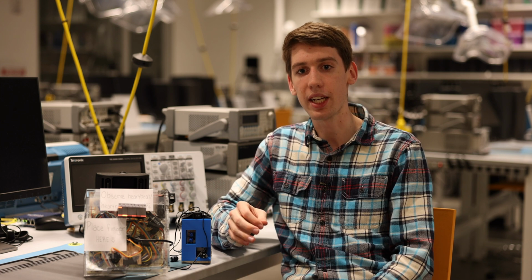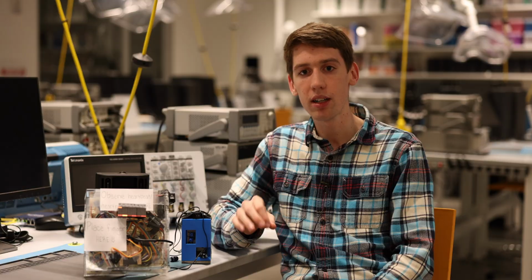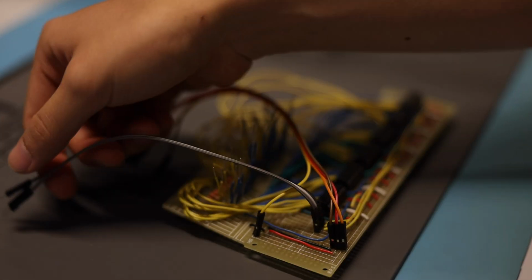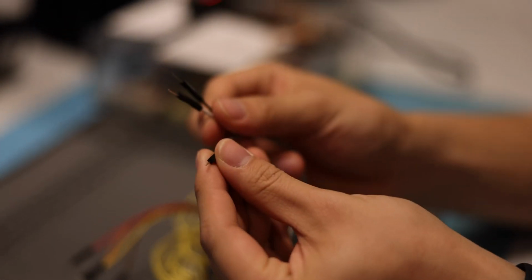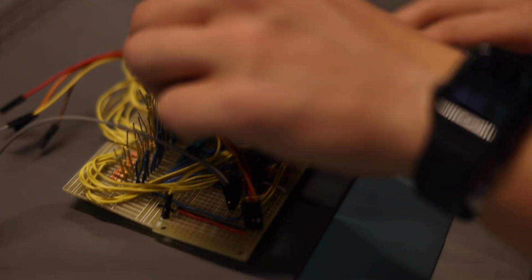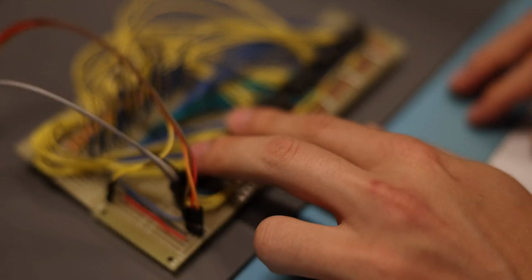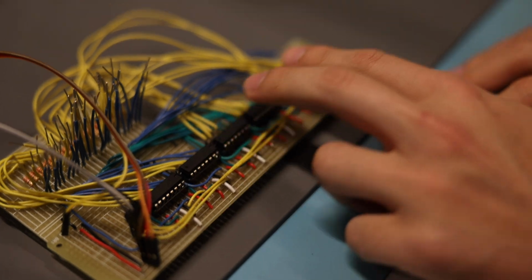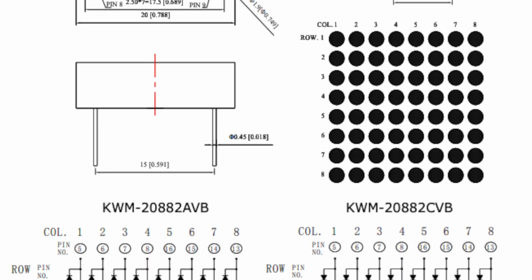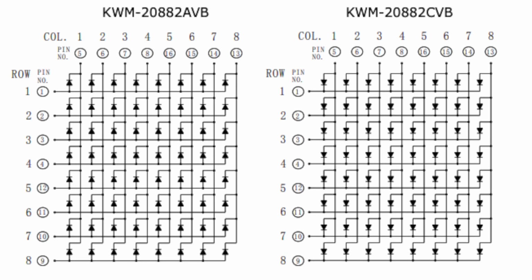Here's how the circuit came together. We have the power, ground, clock, and latch signals. Here we have 3 input signals as well. The shift registers are implemented in sets of 2, where each set corresponds to rows and columns for one display. Next, we attach the outputs of the shift registers to the displays using the documentation provided. Now we just have a coding problem to solve in order to produce a useful output.